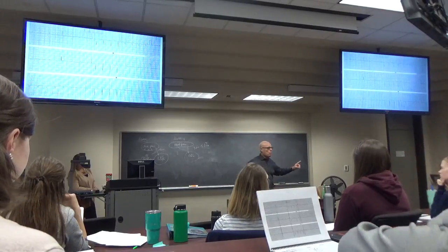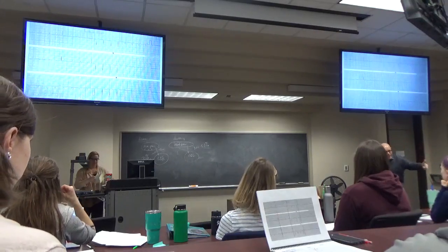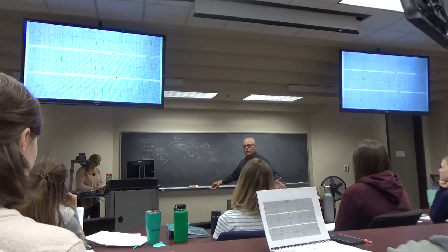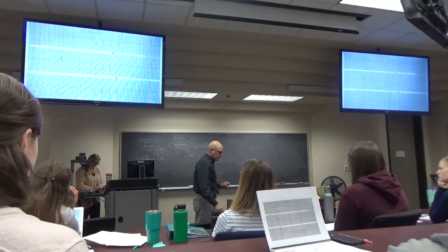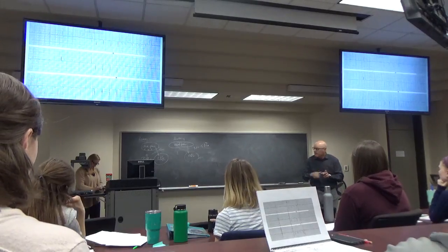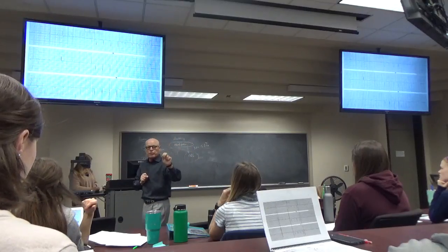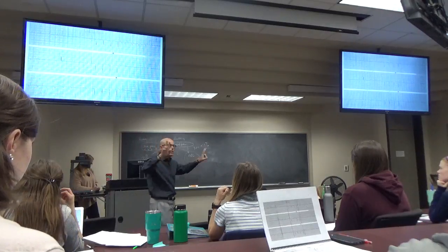But what we do know is they're in different settings. One's having it right now. They look bad. This other one says, well, they're not having it right now, and they've had it a few times in the past 2 weeks. It's a different situation. Okay. So this EKG could look exactly the same in both situations. They could have flipped T waves in 2, 3, and AVF, with maybe a little bit of ST segment elevation, in both situations.